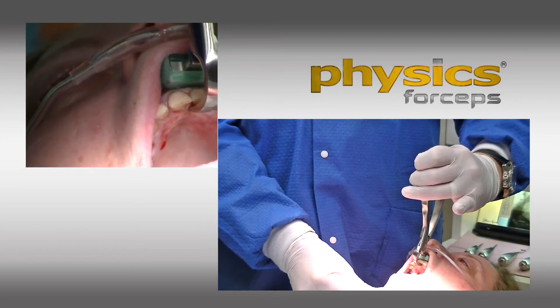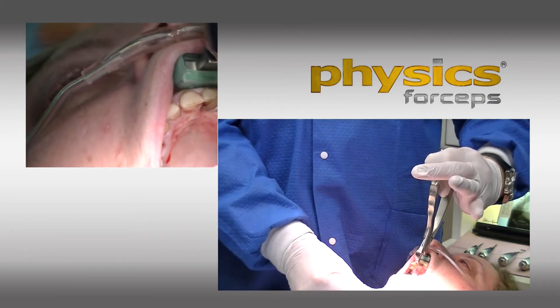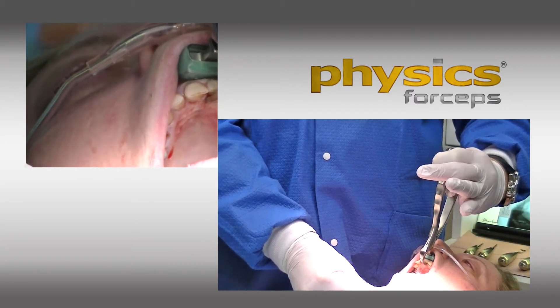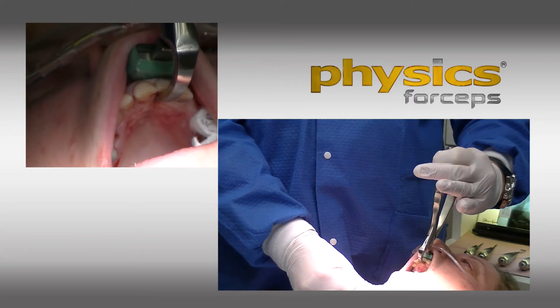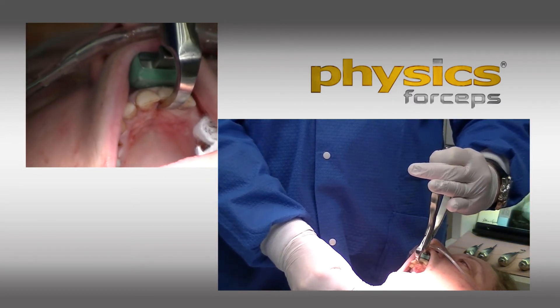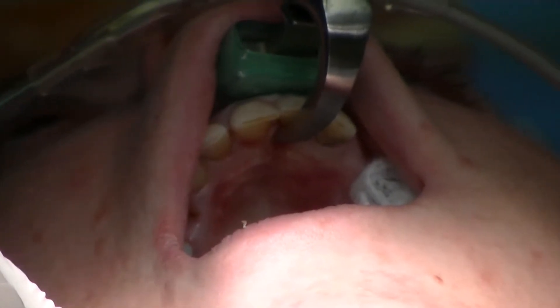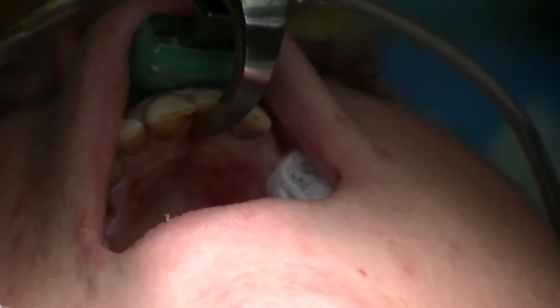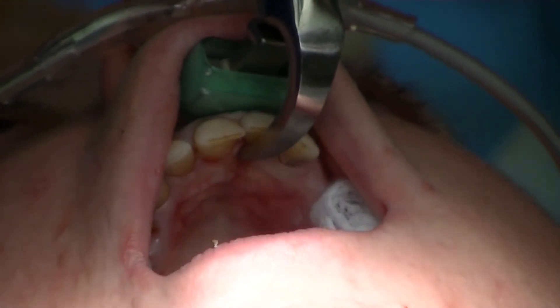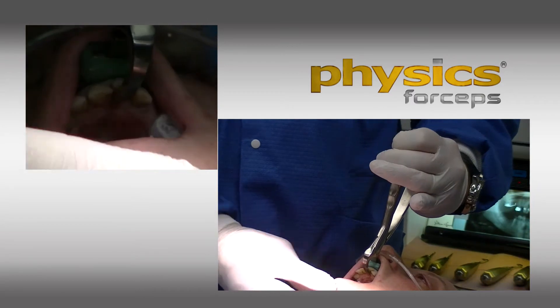It may take a minute or two, which is a long time for us general dentists. You can see I'm really putting no pressure on the forceps — I'm not squeezing it, I'm simply rotating my wrist. Now I'm rotating my wrist really slowly. Just have to give it time. And it just popped — I got some movement. I'm just rotating a little bit more, and you can actually see the tooth move a little bit.